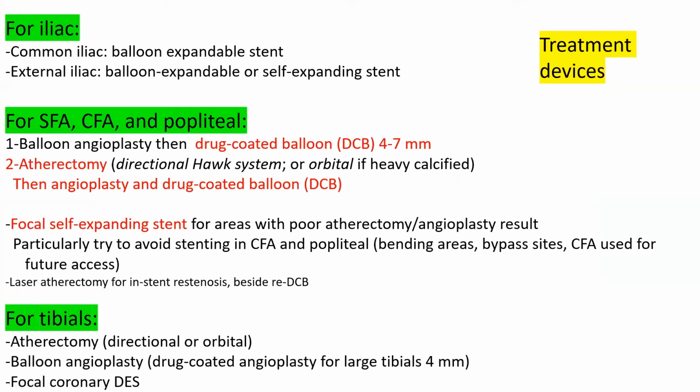This slide, I want to give you a summary. Once we cross that SFA, iliac, or infrapopliteal tibial vessel, what devices do we use? There are a myriad of devices. Unlike in coronary where we cross our stenosis, do balloon, then stent, standard balloon and standard stent, here it is much more complex with a lot of options. Stenting, I will give you, is not the standard approach in femoral and infrapopliteal disease. Stenting is a standard approach in iliac disease, but not in those two.